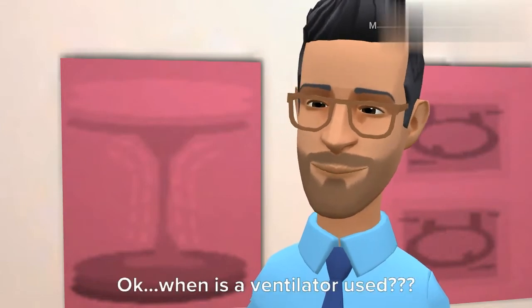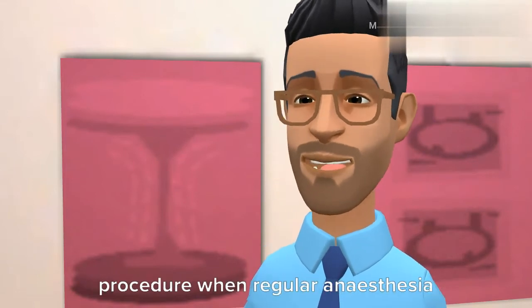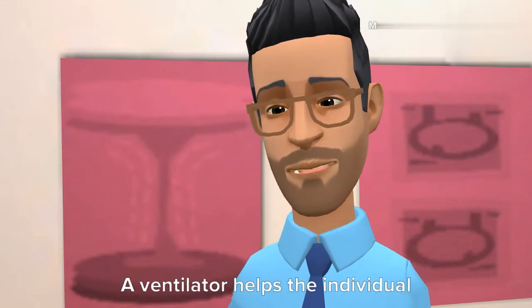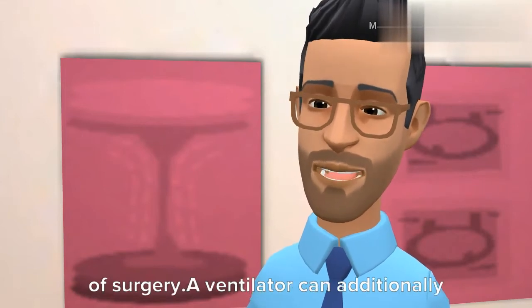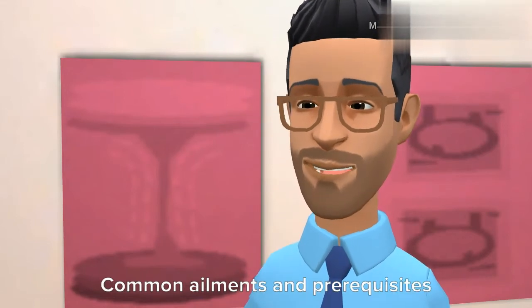Okay. When is a ventilator used? A ventilator is used during and sometimes after surgery when general anesthesia is given. Anesthesia causes sleep and relaxation during surgery. A ventilator helps the person to continue to breathe during surgery. A ventilator can also be used if the person has a condition that affects normal breathing.